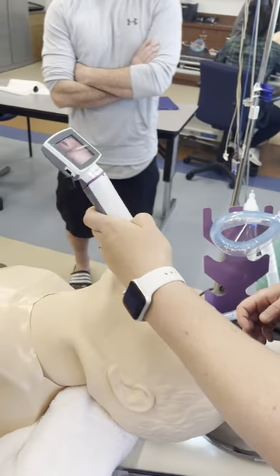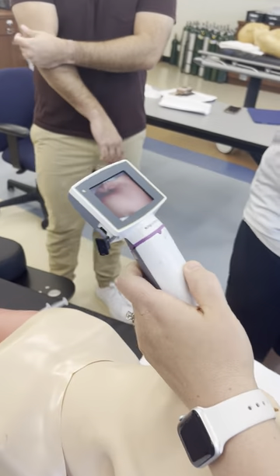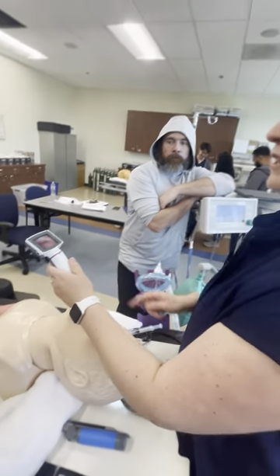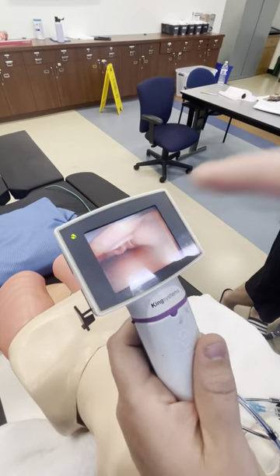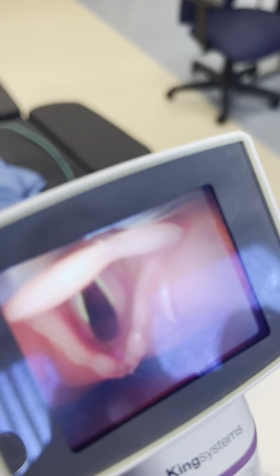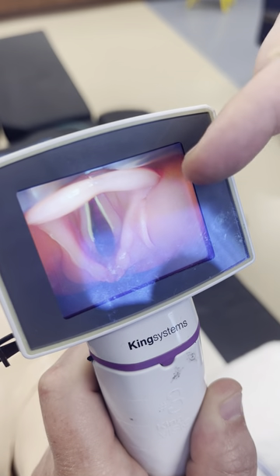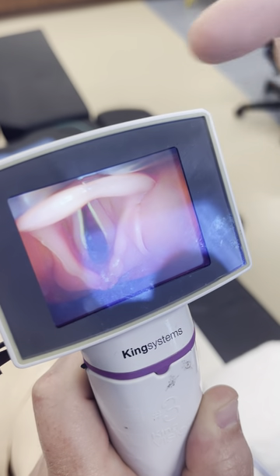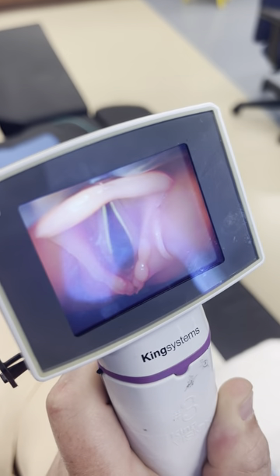With a MAC blade — this is a little more curved than a MAC blade — you want the placement at the tip of the blade here. You can see the epiglottis, and I'm between the epiglottis and the base of the tongue, which is now being lifted by the blade. That's the MAC blade placement.